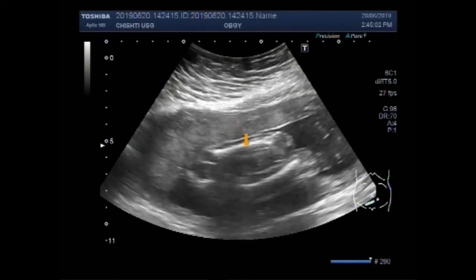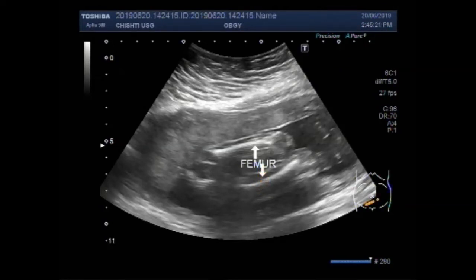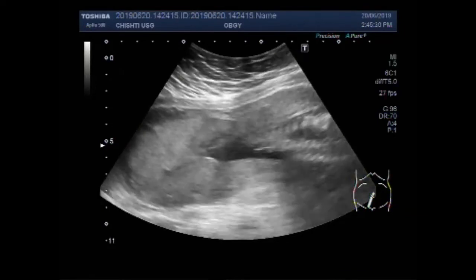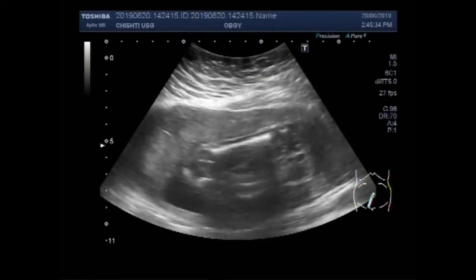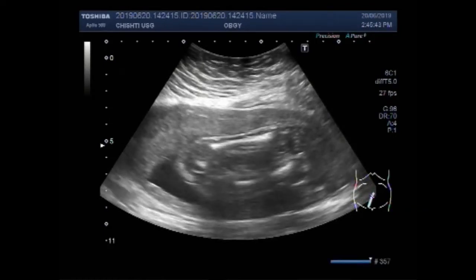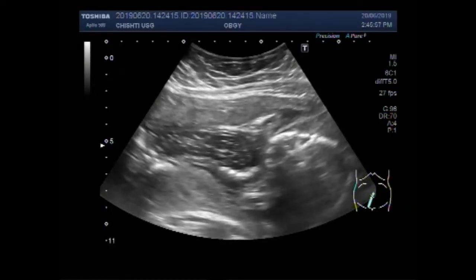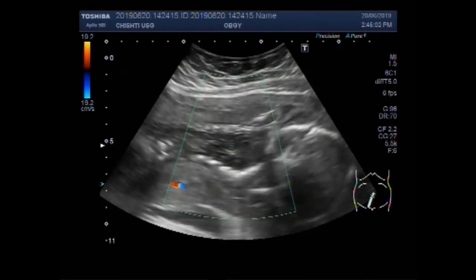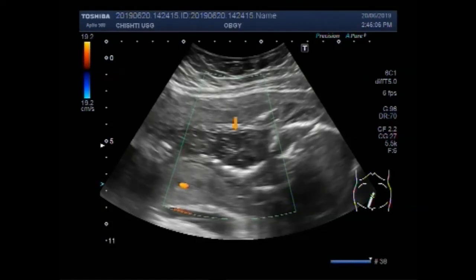These are the two femurs, and this is the other femur. You can see there is no fetal movements, no fetal cardiac activity. Now you can see there is no blood flow — this is also visible in the fetus.